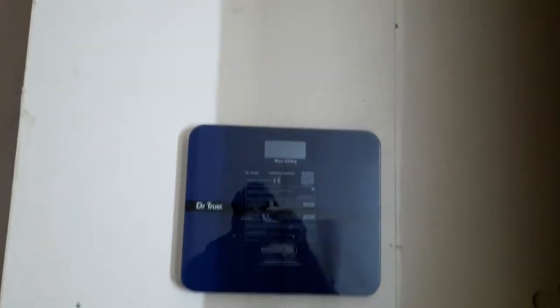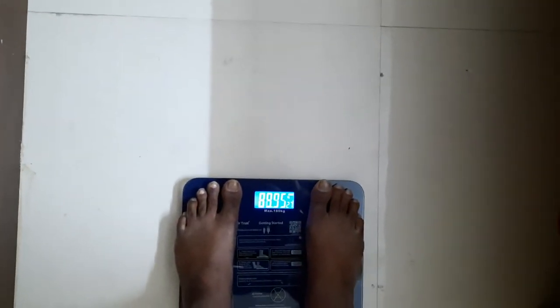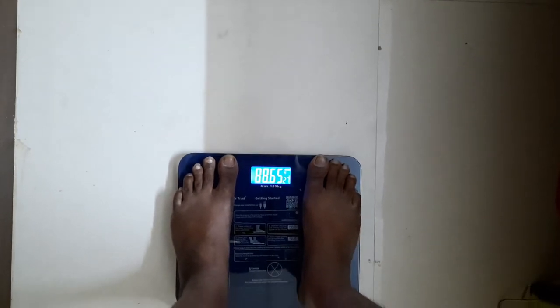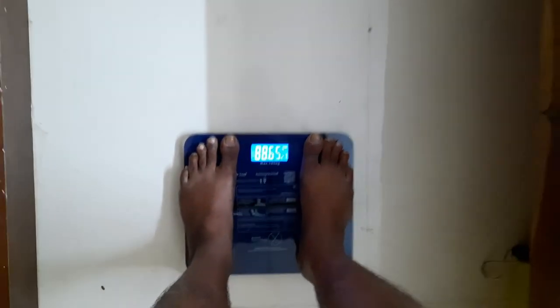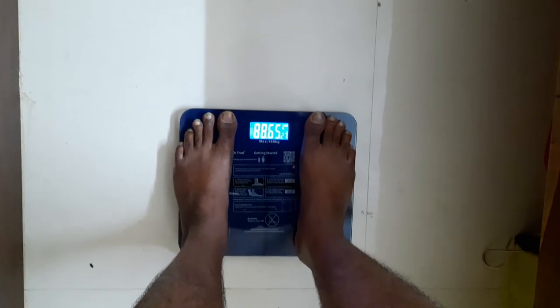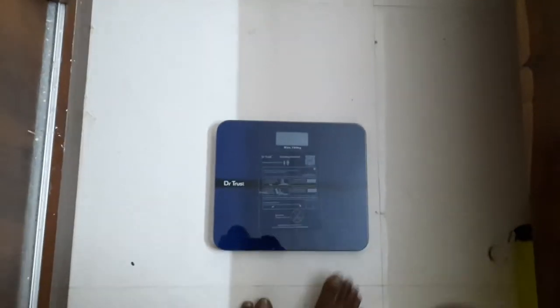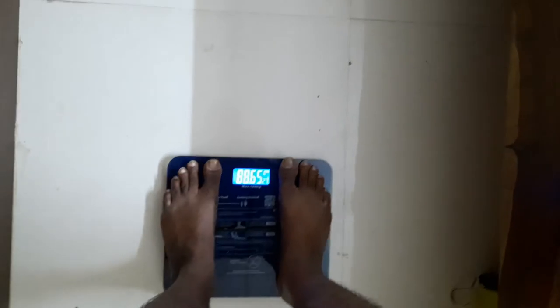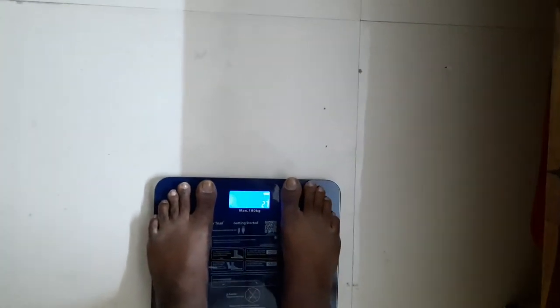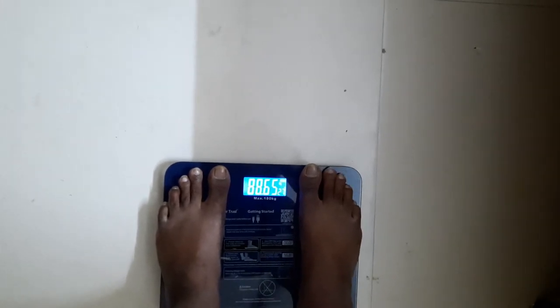I placed it on the floor and it is showing 0.00. I think it automatically turns off when not in use. It looks like it is showing the right weight value. Checking again — it is showing the same value as before, which is perfectly fine.